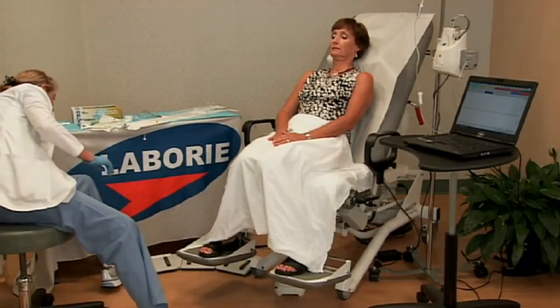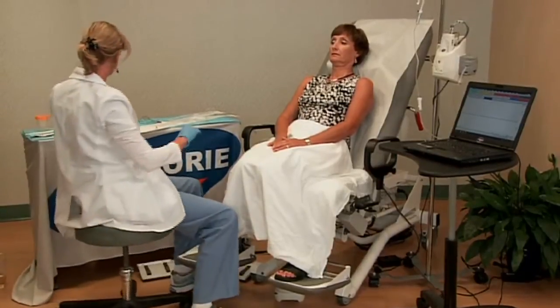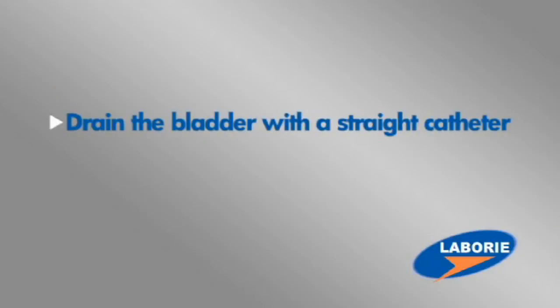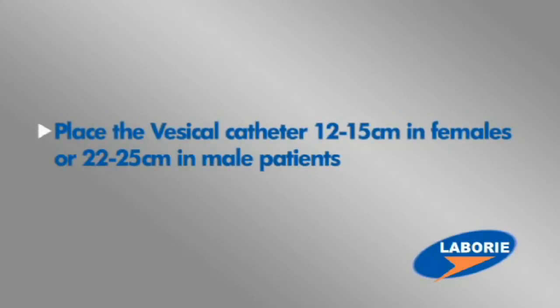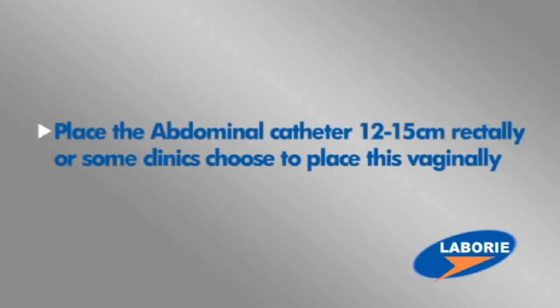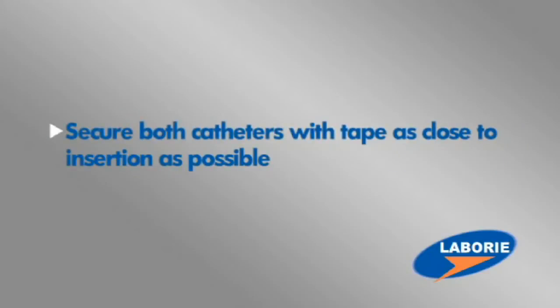It's now important to prepare the patient for the filling phase of the test. First, drain the bladder with a standard straight catheter, noting the volume as post-void residual. Place the vesicle catheter 12 to 15 centimeters in females or 22 to 25 centimeters in males. Place the abdominal catheter 12 to 15 centimeters rectally, or some clinics choose to place this vaginally. Secure both catheters with tape as close to insertion as possible.